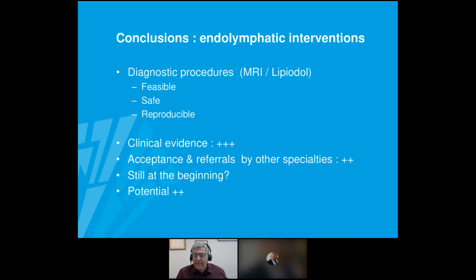So in conclusion, there are today more and more diagnostic procedures to opacify the lymphatics, both with use of MRI and with use of X-ray. When you do it with MRI, then of course you need gadolinium-based contrast media.